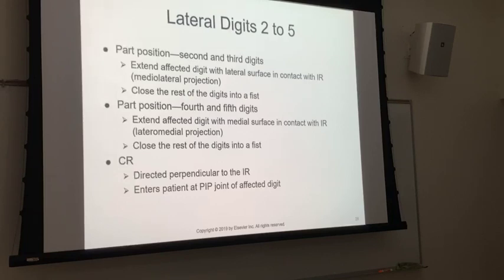Most of the time that's going to be AP and lateral or PA and lateral. In the fingers it's going to be PA and lateral. So we're always going to do at least 2 views, probably 3. We're going to try to position the patient so that we get the best image without distortion. Well, what's distortion? Distortion is a misrepresentation of the anatomy. We've got a lot of different types of distortion, okay? If I'm looking at the shadow of this, I want this to be as close to the screens as possible so I don't get magnification, right? With the magnification, what do I get?